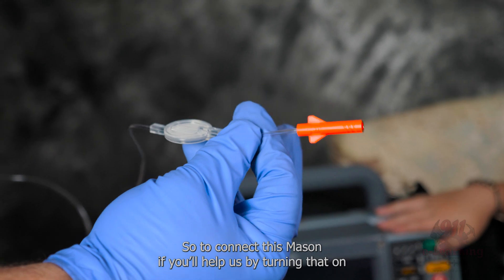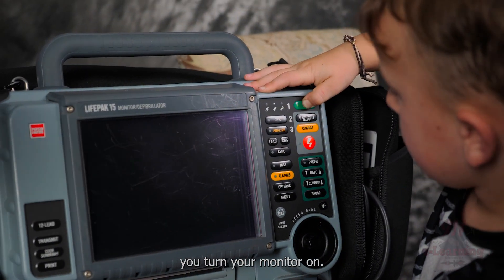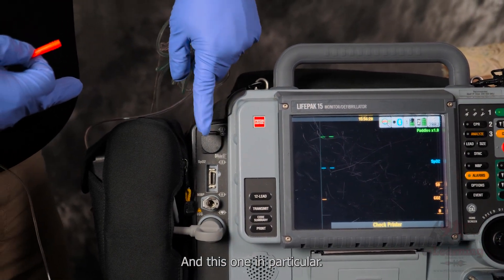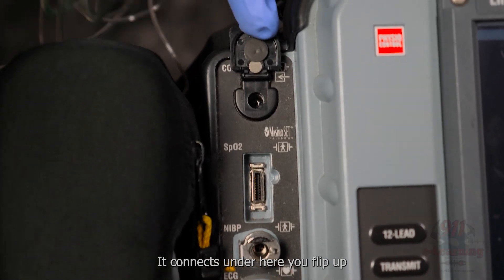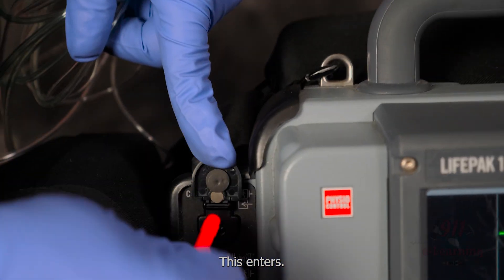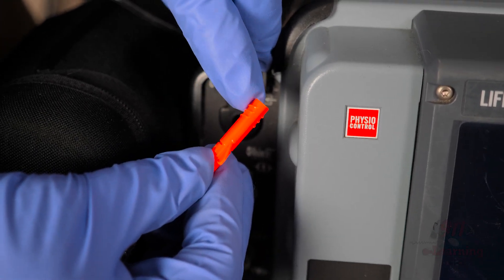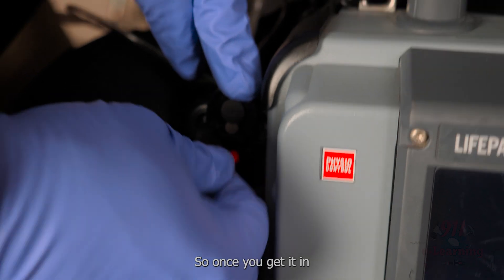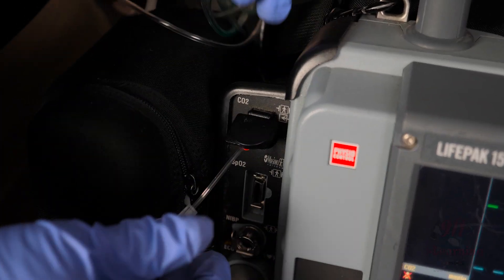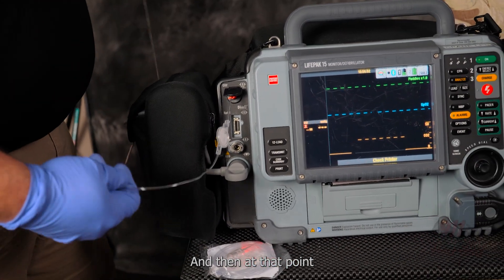To connect this — Mason, turn the monitor on. This is a LifePak 15, and on this one it connects under here. You flip up the flap, insert it, and if you look real close you can see it's threaded. Once you get it in, you twist it — just a couple of times and it gets good and snug. And then at that point it starts to measure.